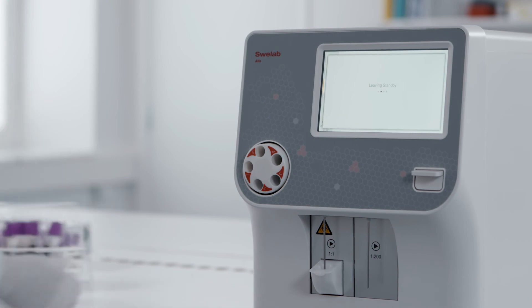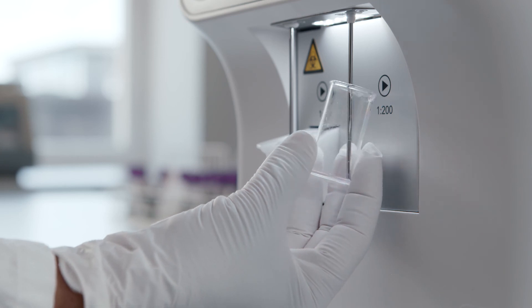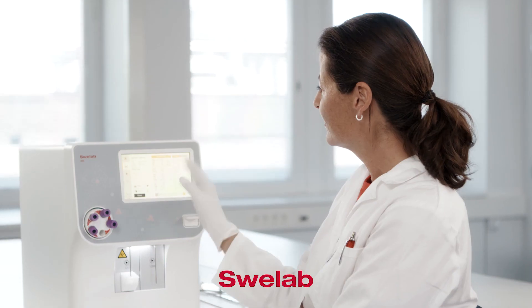In summary, Swelab Alfa Plus haematology analyzers are better equipped than ever. A broad spectrum of modern technologies boosts the reliability and ease of use that has been their hallmark for many years of successful operation around the world. For results you can trust, there's never been a better time to put one in your lab.